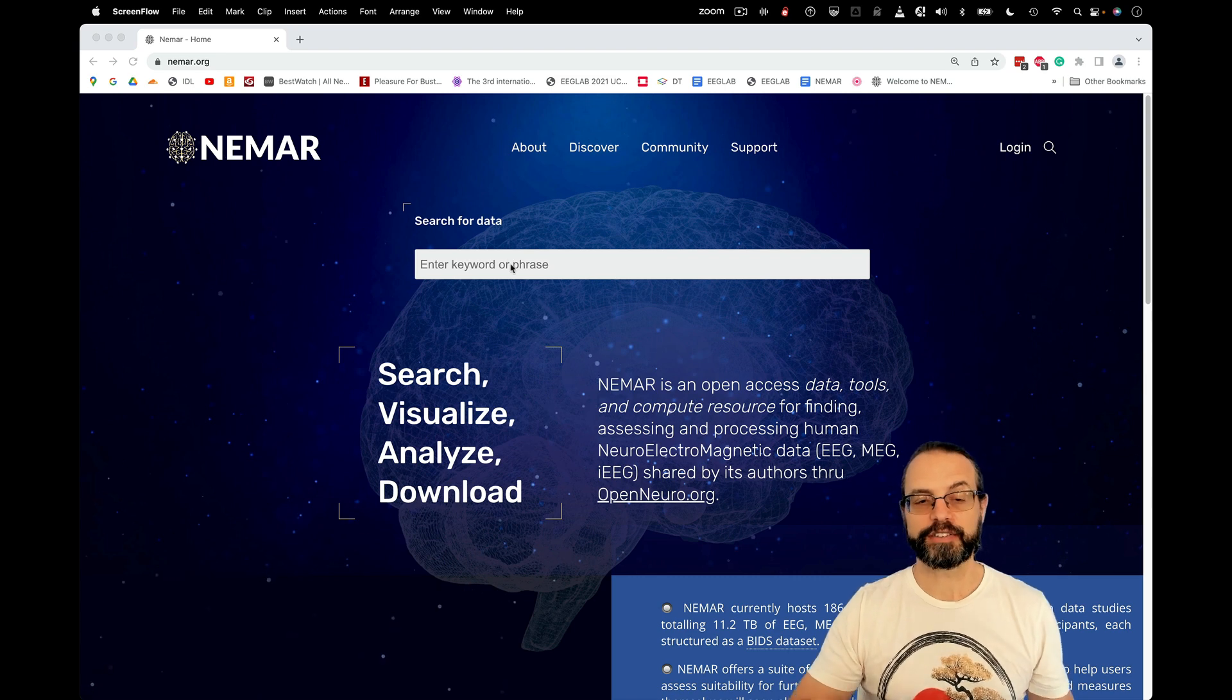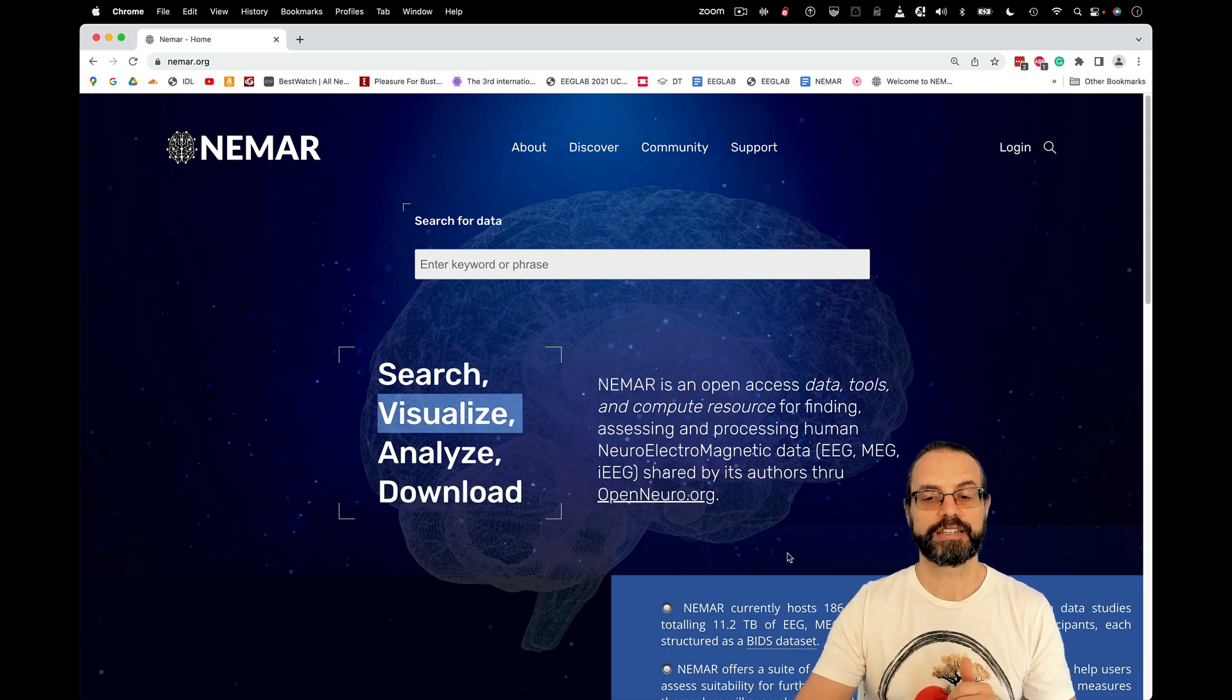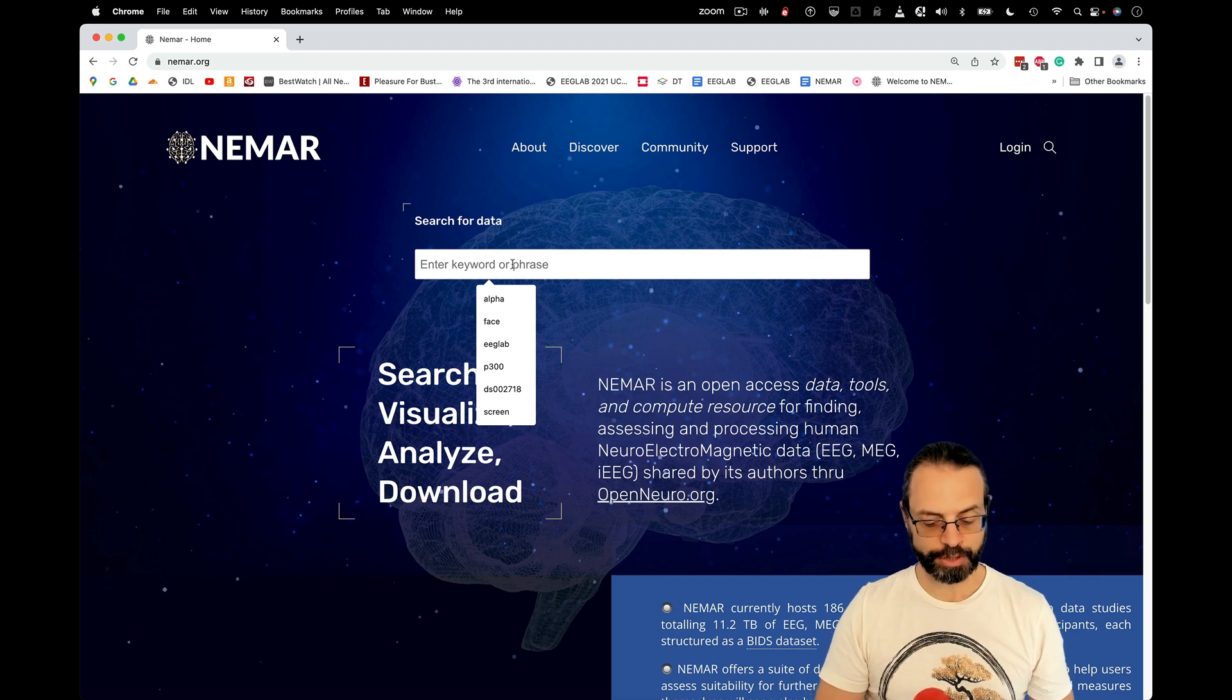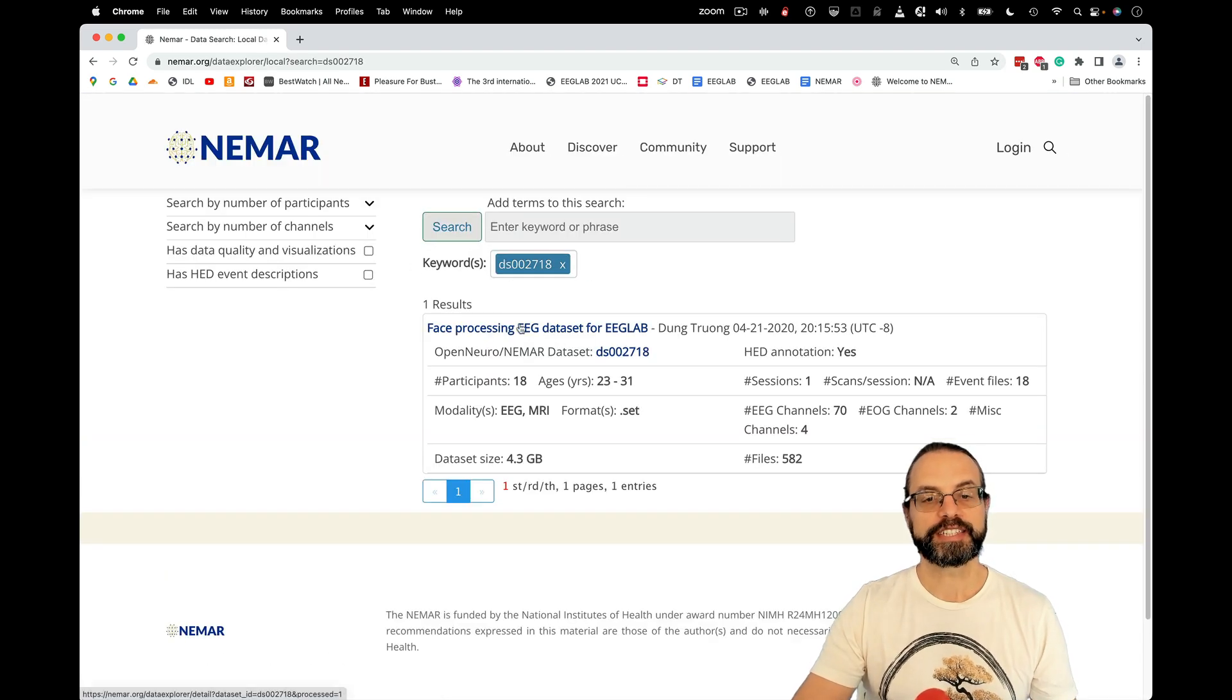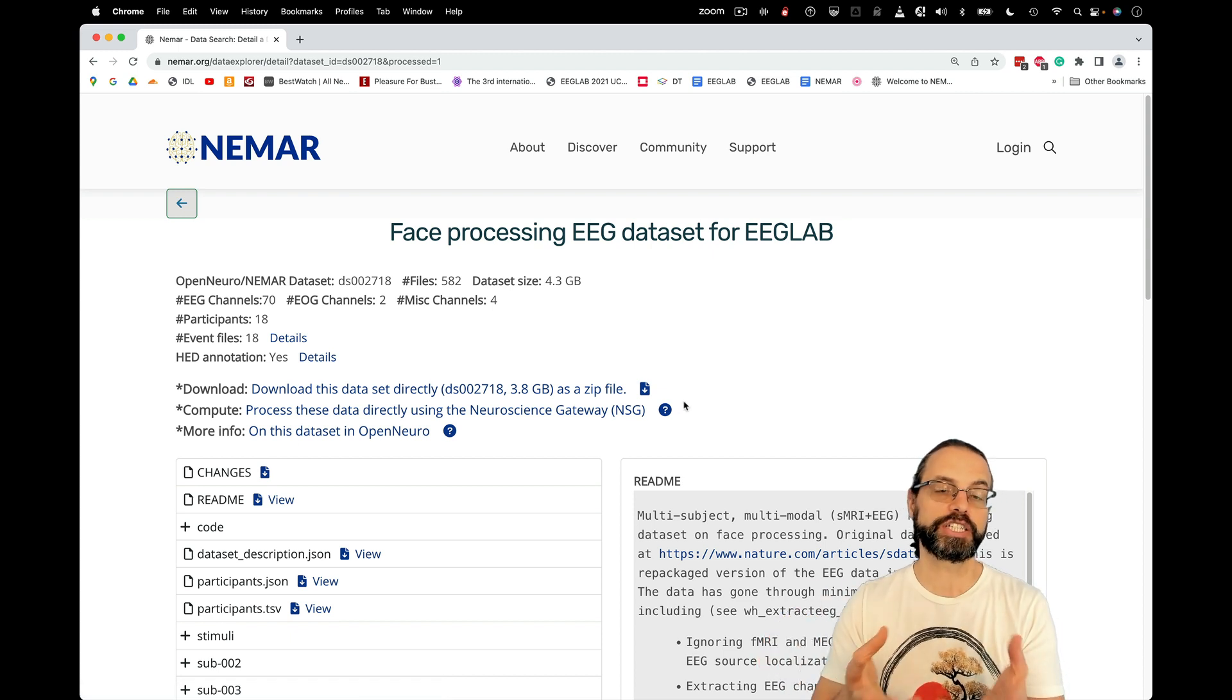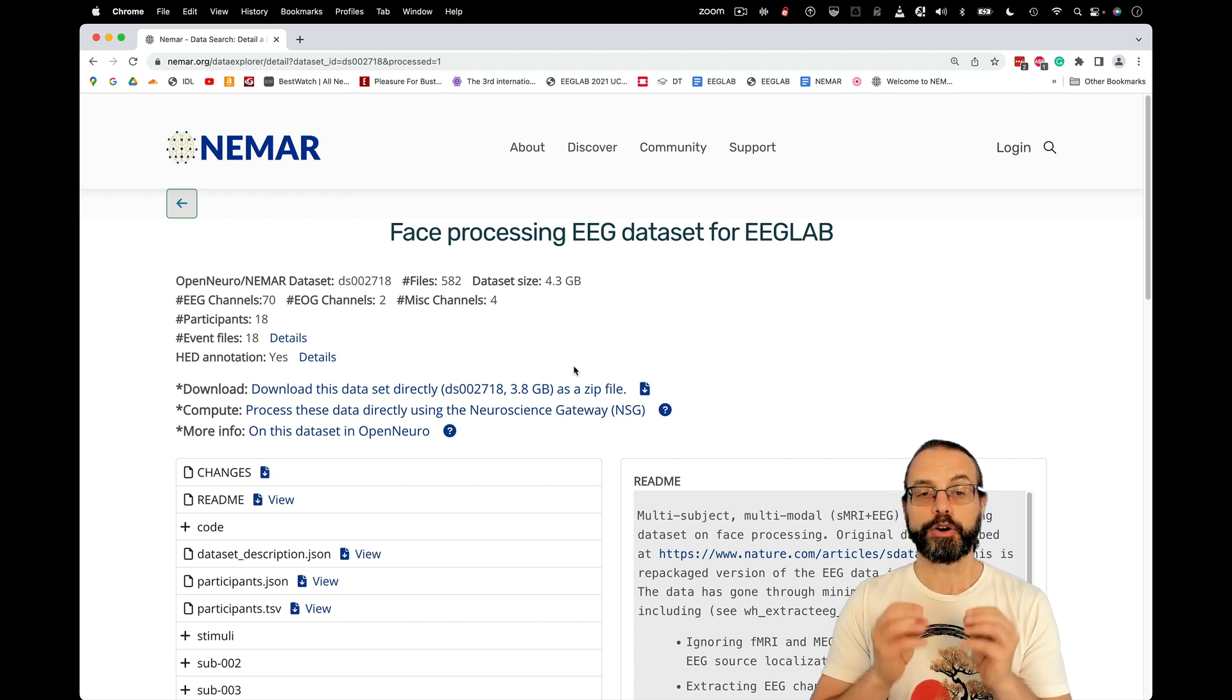This has all kinds of EEG and intracranial EEG datasets. You see here about 186 experiments are stored. I'm going to demo specifically using one of the datasets that's called DS002718, and this is Face Processing EEG dataset. This dataset is very popular in the community because it has EEG, MEG, fMRI.